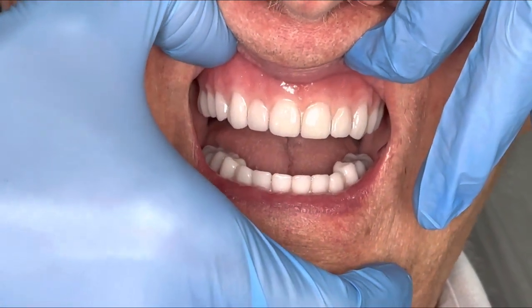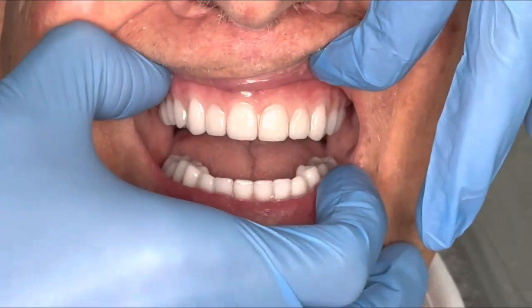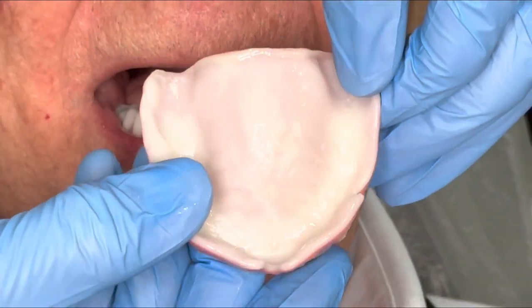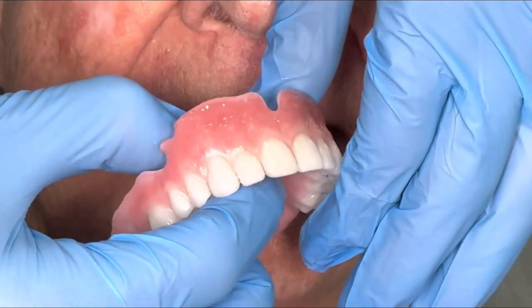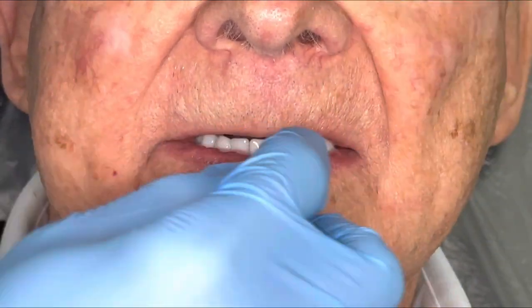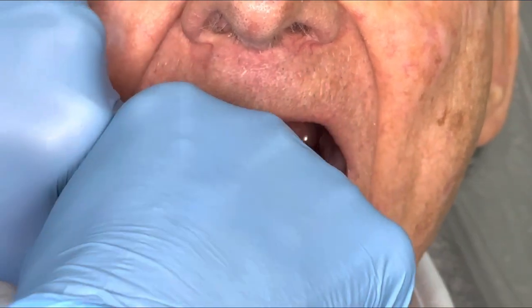You can see I'm going to get on the top of the flange here and push down, just not turning loose. So I'm going to get back in the back here and pop that down. You can see we've got a nice posterior palatal seal here. This is annex gum finish. I think it looks very nice. And then our 3D printed prosthetic on the lower.